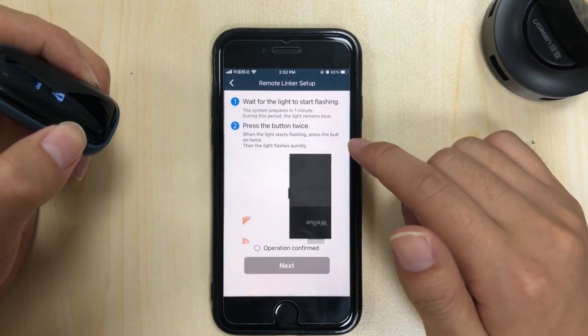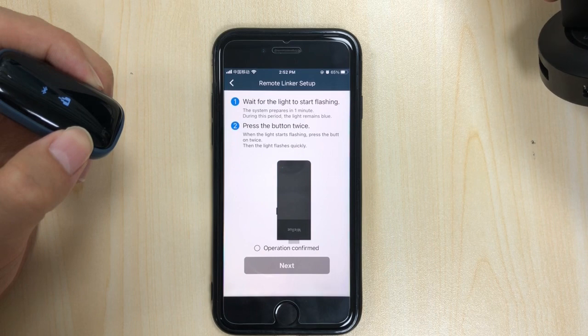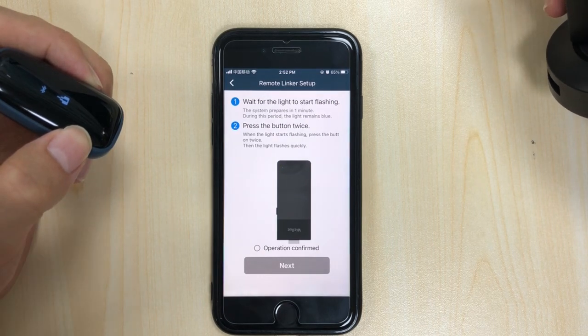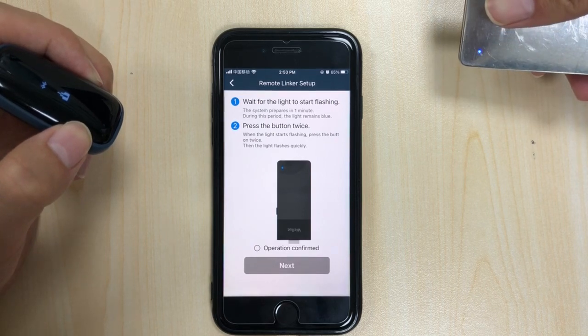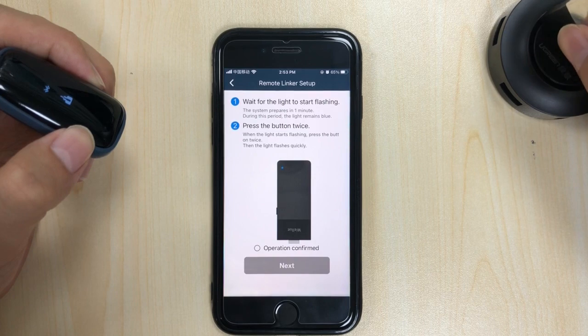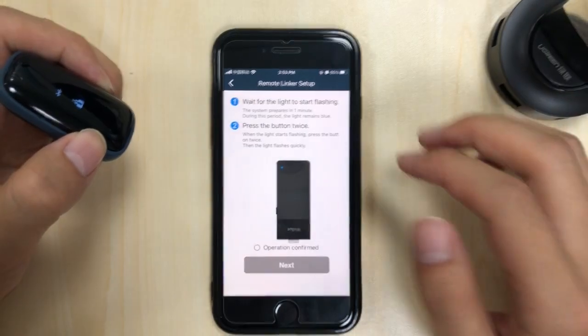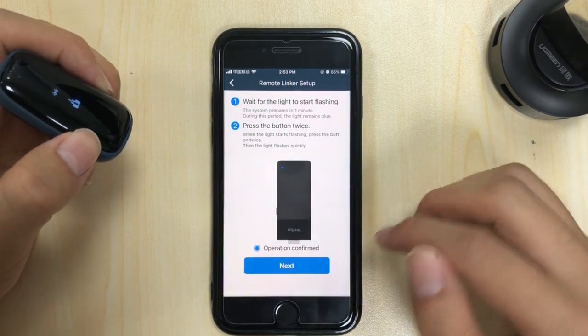Wait for the light to start flashing. Once you can see it's flashing, double press the button. I have pressed it twice — operation confirmed. Tap next.